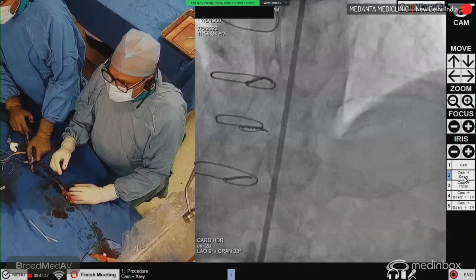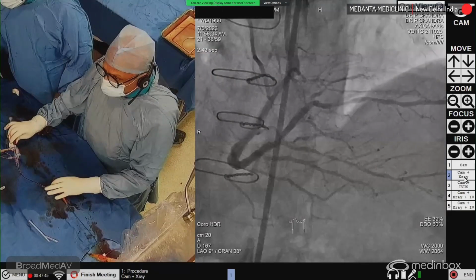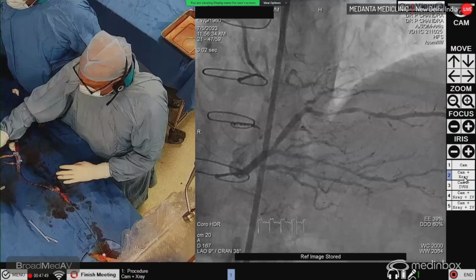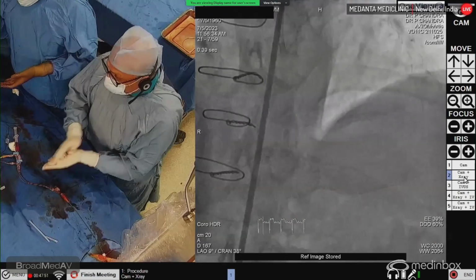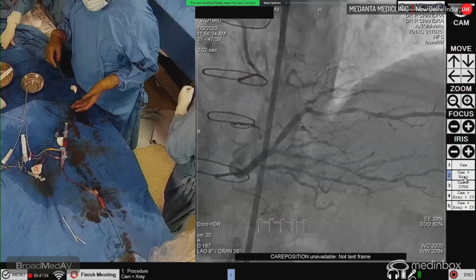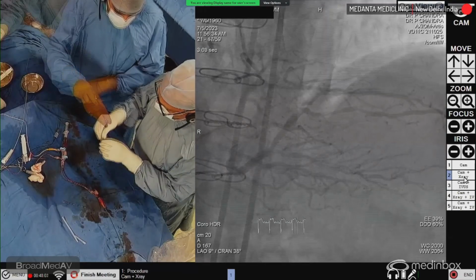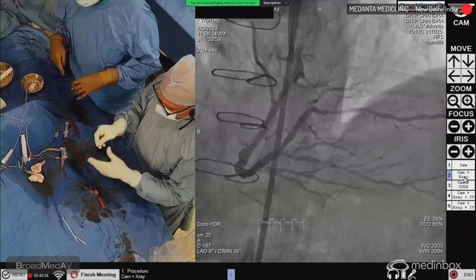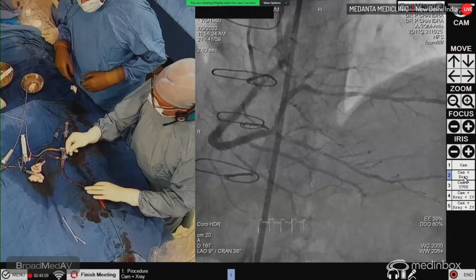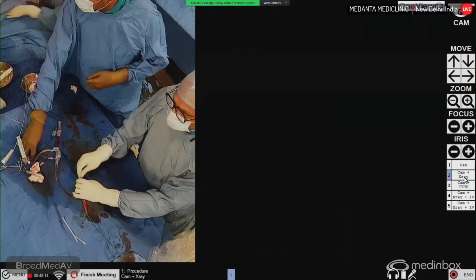That is the point. Okay. So we will see if we are able to go through this. Give me a wire, please, BMW. And also in this situation, we might have to use a guide extension catheter, because there will be issues of crossing this distal lesion from the proximal very calcified segments. Also get an EL guide +2, which is from Nipro. Okay, LAO, please go to LAO.